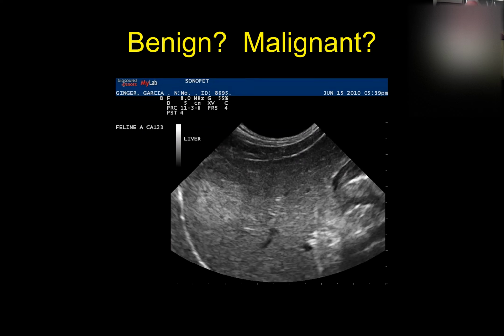Okay. So how do we tell by looking at these nodules or mass lesions inside whatever organ we're talking about if it's most likely to be benign or most likely to be malignant, realizing it's not perfect and we're still going to have to put a needle in it. Okay. So if I look here, here's a piece of liver down in here. Falciform fat up here. Here's a diaphragmatic margin. Here's stomach sitting back in here, but he's got this abnormal kind of hyperechoic nodule in the liver.